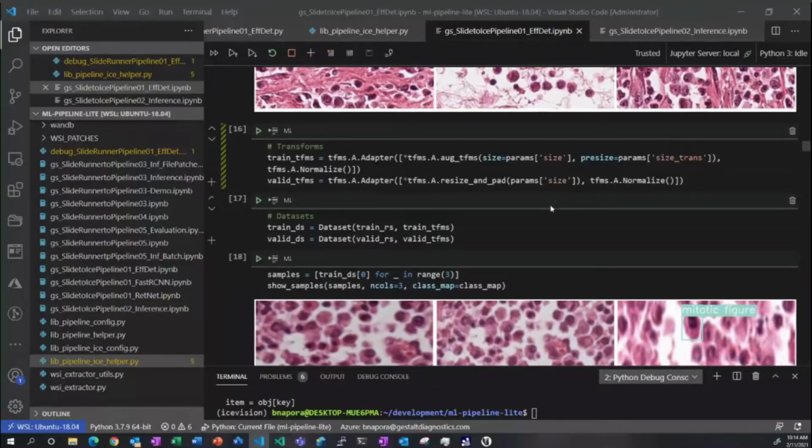That might explain why you don't see them, that even if you have a high score, as the map is 86, it might be that the precision of the medium size boxes is lower than that. I don't know if my explanation is more clear, or more confusion. Well, that's a great call. I need to run a couple experiments with different sized boxes.